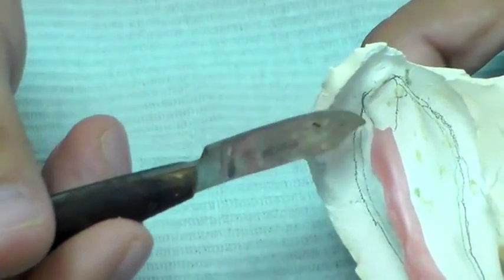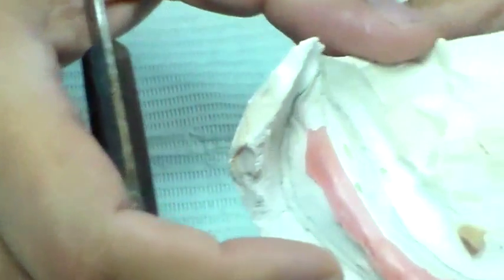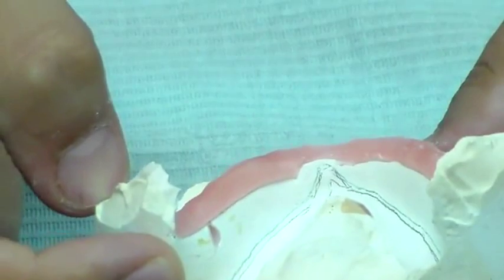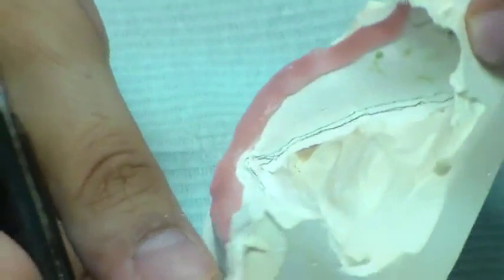I have marked out my retromolar pad and gone into the lingual where I have marked the same thing. In the lingual anterior portion, I have opened out a frenum notch — you can see it corresponding to the frenum.